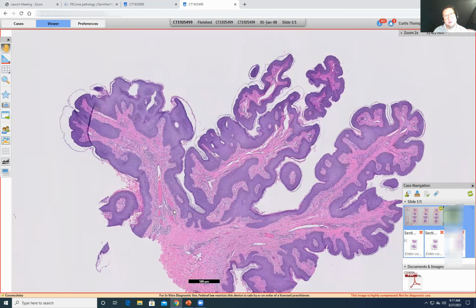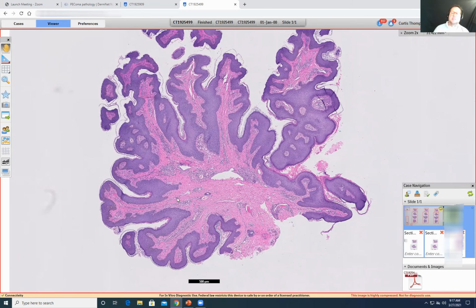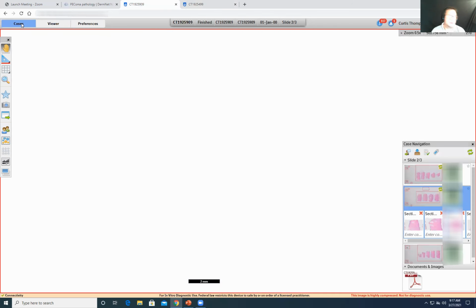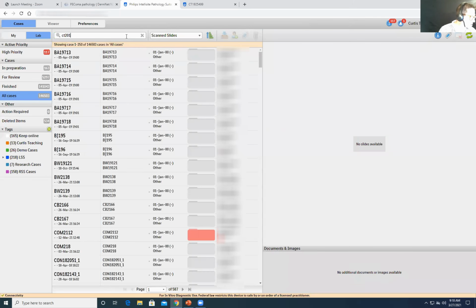And the reason we went to calling it organoid nevus is because you see more hamartomatous change of the adnexa than just sebaceous. So nevus sebaceous is too limiting for it. But I recommend having a lot of give in these. If something isn't clear, just back off and call it a hamartoma, a nevus, and leave it there, and don't try to pocket it too carefully. That's all I'll say about that. That's a big subject. There's a whole lot more with epidermal nevi, organoid nevi, and syndromes, but that's all we'll touch on today.